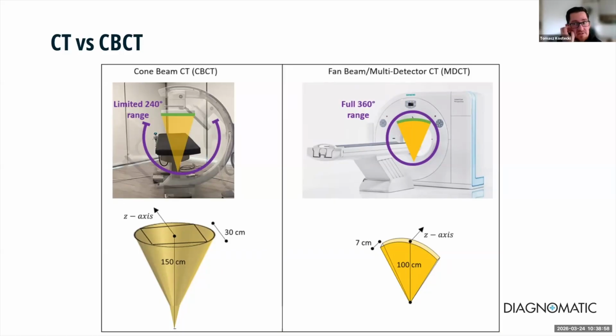The cone beam CT is a variant type of computed tomography. Although it has many advantages, the two main disadvantages are increased scatter radiation and cone beam artifact if an inappropriate reconstruction algorithm is in use.